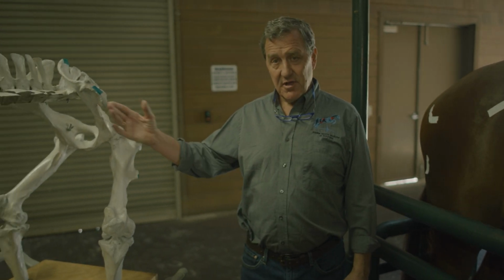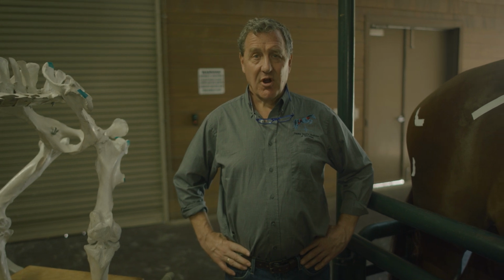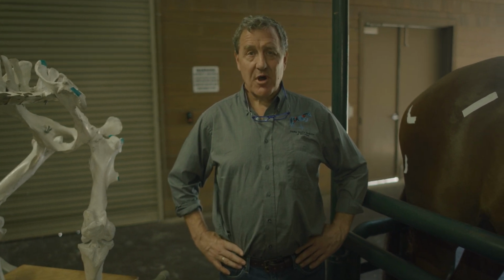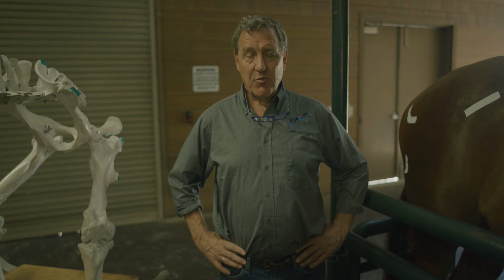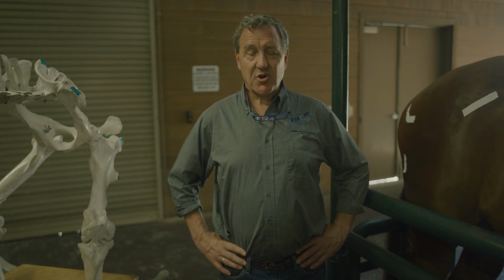specimen here. When we're doing external pelvic ultrasound, it's usually in regard to a traumatic incident that the horse has sustained, and we're trying to sweep bone surfaces. Ultrasound is the most sensitive tool for bone surface detail, and we want to take advantage of that to outline all the bones in a traumatic situation.